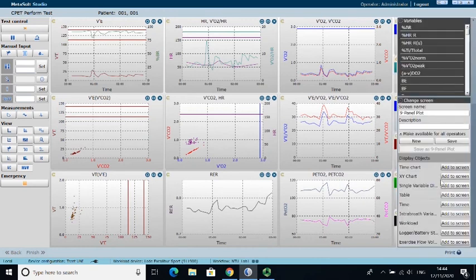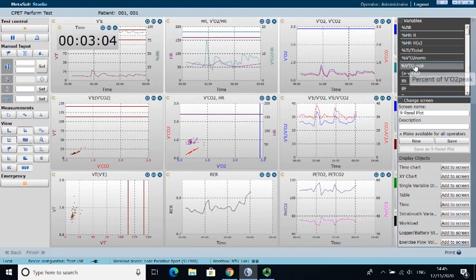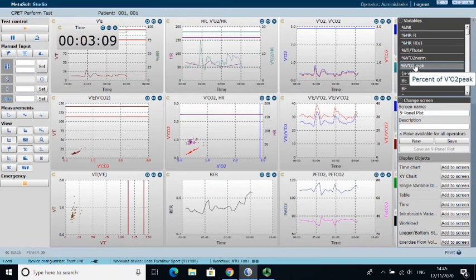So now I'm going over to the grey bar on the right hand side again. I'm just going to add back in time like I did before, and now I'll be telling my participant that it's time to start cycling. What I ask them to do is cycle between 60 and 70 revs per minute, simply because it's a reasonable pace to maintain, and it's the rate that we use for our patients during the testing. However, many years ago when I did it, they were asked to maintain that rate.